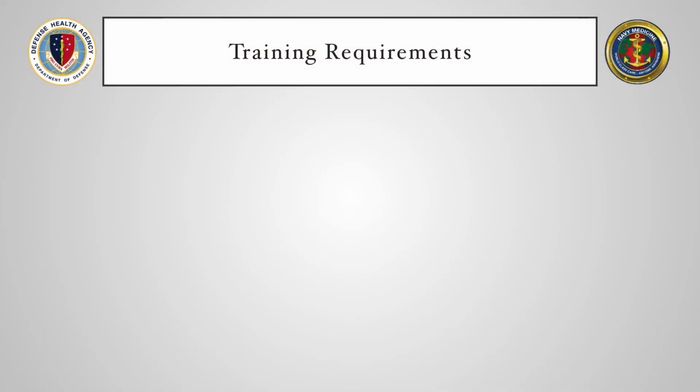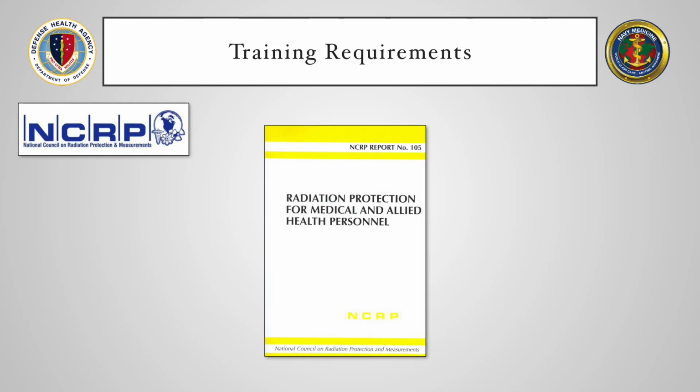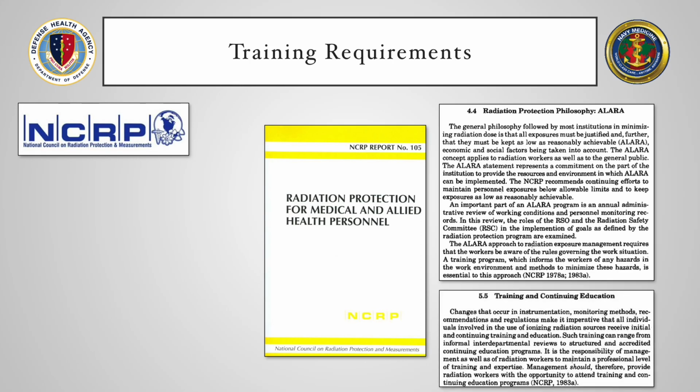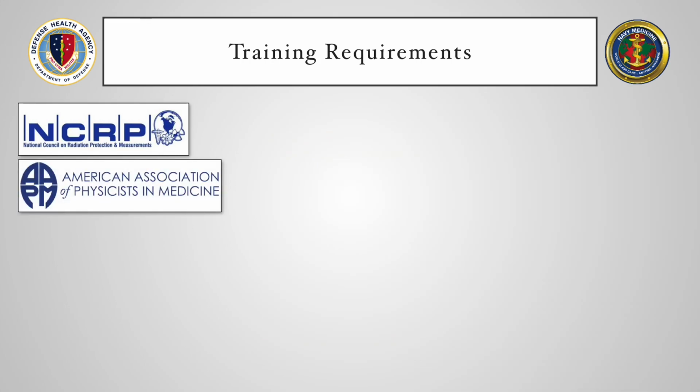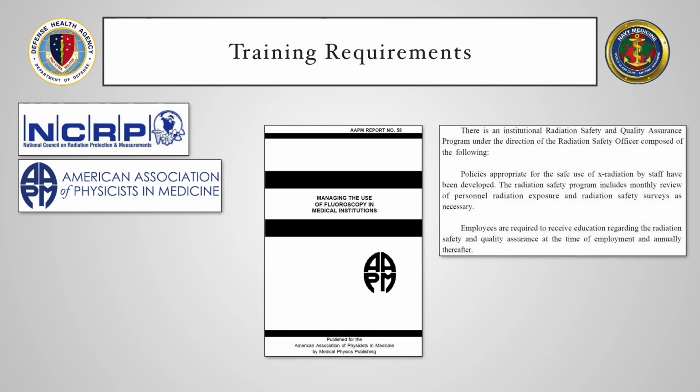The first thing that comes to mind: why exactly am I doing this training? Well, the National Council on Radiation Protection and Measurements has a report, 105, that states all radiation workers need to be aware of all rules and practices in the work situation that contribute to effective radiation exposure management. The American Association of Physicists in Medicine has a 1998 report, number 58, that states an effective radiation protection program requires employees to receive annual education.